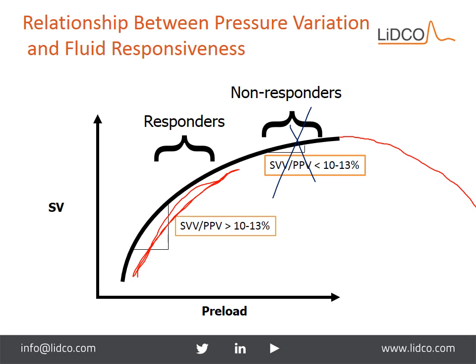And so what's so cool about this concept of functional hemodynamics is we can find out when we're right here, and we can start making better decisions on, whoa, if our patient is still not perfusing at this point, and they're no longer responding to fluid, what are our choices? Well, we have choices. We can give a vasopressor, we can give an inotrope, we can do alternative maneuvers besides give fluid and therefore do no harm.